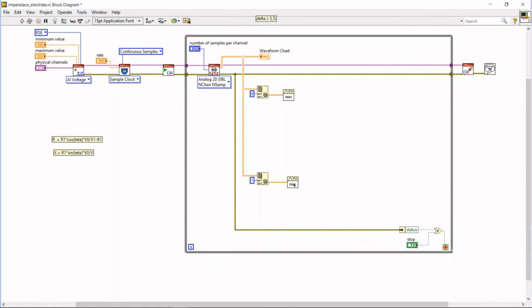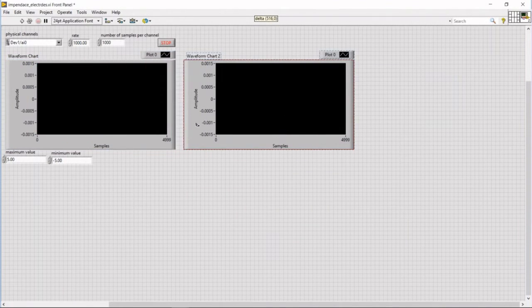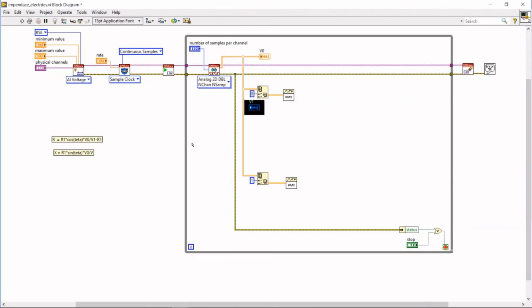Next, let's place some indicators of our voltage, so graph indicators. I'm going to open the front panel and copy this graph. I'm going to name this V0 and this V1, and disconnect these two, and this is V0 and V1 is this one.